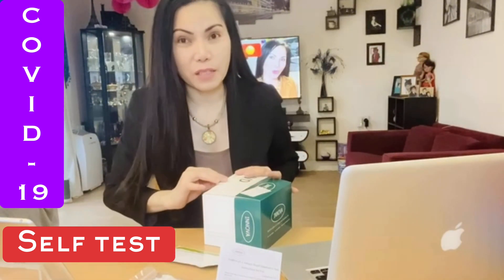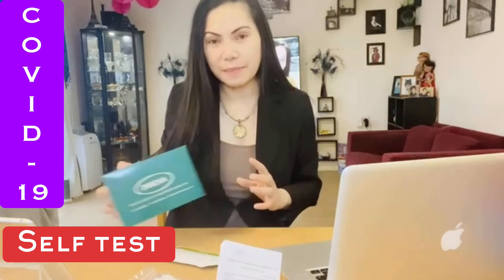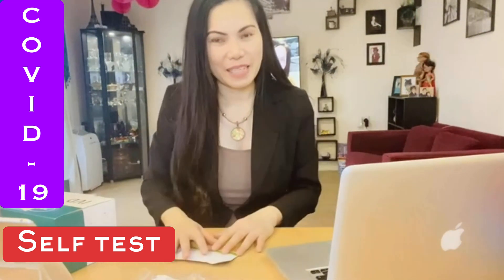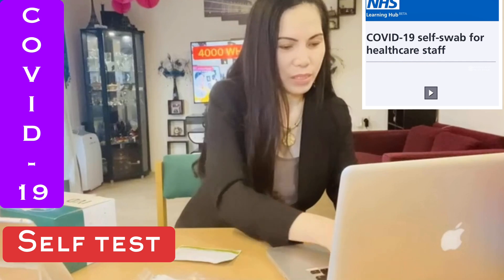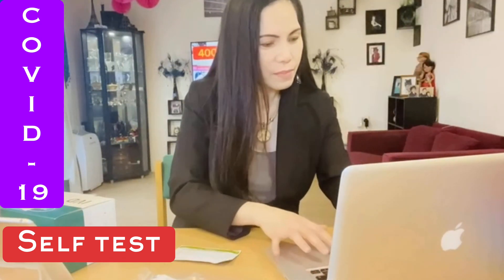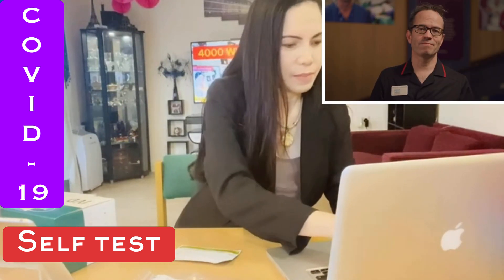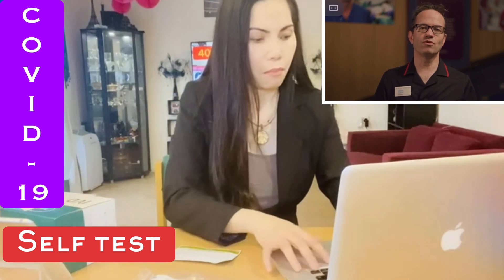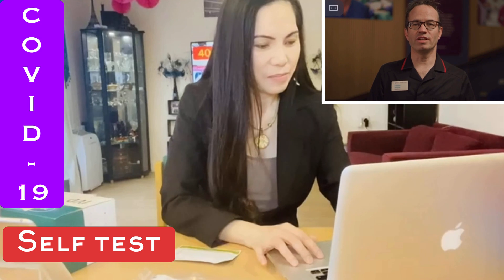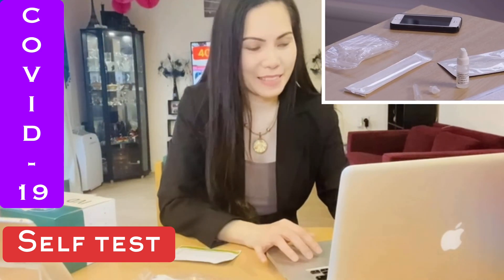I'm going to start the test now. We've been instructed to follow a specific video, so I'm going to listen to it and do it at the same time, so I'll be guided accordingly. The video says it is designed for healthcare staff and clinical educators for teaching the technique of self-administering a lateral flow COVID-19 test.